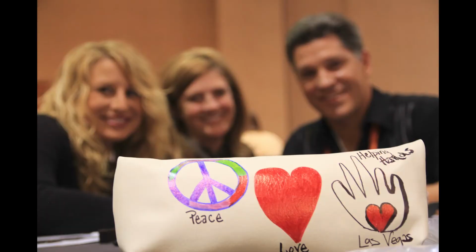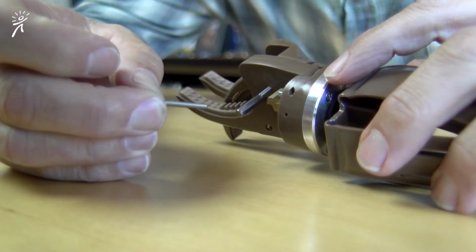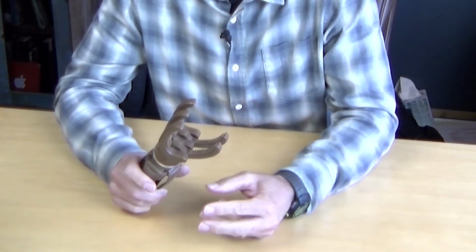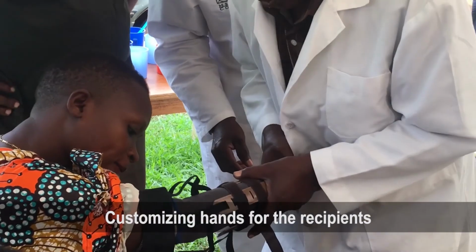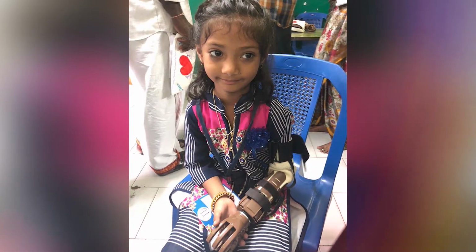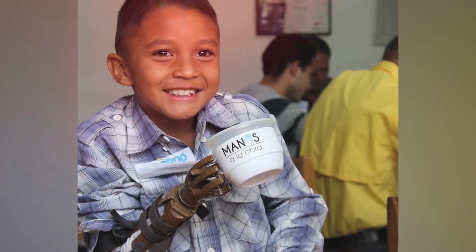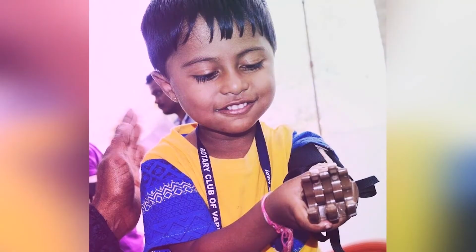We have two sizes of hands. One size we call regular, and another size which we call large. We do not call them children and adult. The reason for that is because sometimes a small or petite adult, the right hand for them is the smaller one. So if we were to call it a child-sized hand, that would not be well received. And similarly, on the large hand, if we call it an adult hand, a child or a large child, or a teenager, or perhaps their caretaker, would not want that person to have a hand that would be for an adult. So again, we call them regular and large.